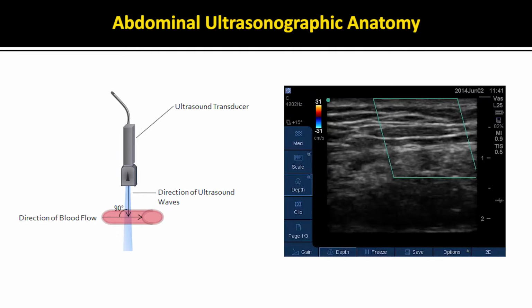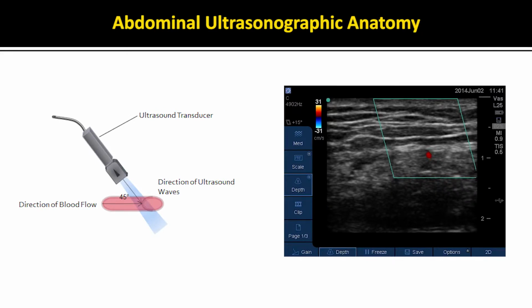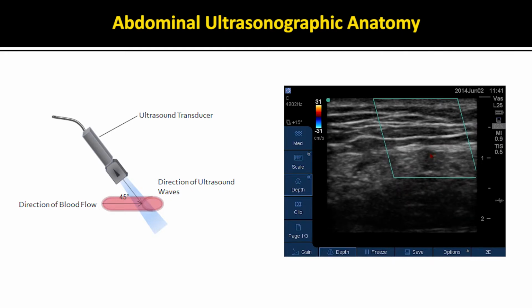When the transducer is perpendicular to the flow of blood, no color Doppler signal is shown on the screen and the vessel cannot be visualized. When tilted oblique to flow, a vessel can clearly be seen, overlaying the site of possible paracentesis. Proper use of color Doppler technique prior to paracentesis can help avoid inadvertent vascular injury and potentially serious subcutaneous bleeding.